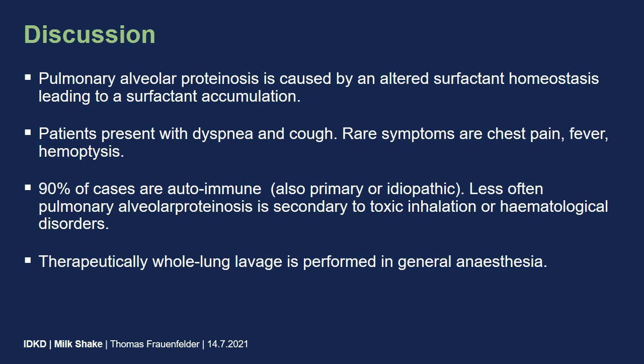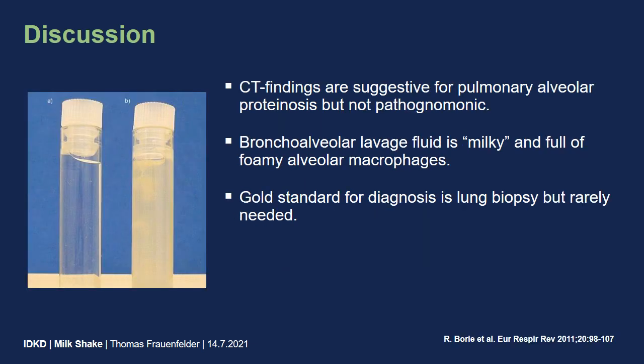Pulmonary alveolar proteinosis is caused by altered surfactant homeostasis and leads to surfactant accumulation in the secondary lobule. The patient presents with dyspnea and cough, but other symptoms are rare. 90% of cases are autoimmune, but as in our case, it can also appear after toxic inhalation or hematological disorders. CT findings are suggestive for pulmonary alveolar proteinosis with the crazy paving, and in combination with clinical findings and especially the bronchoalveolar lavage, it is diagnostic.